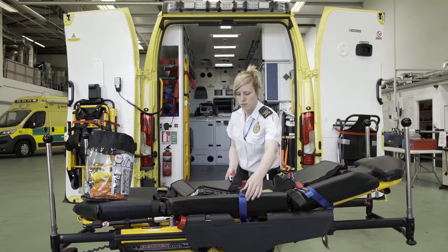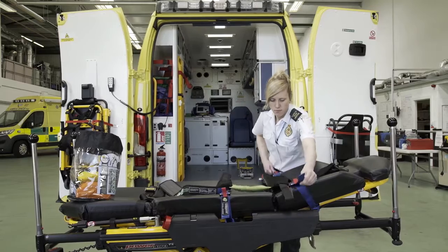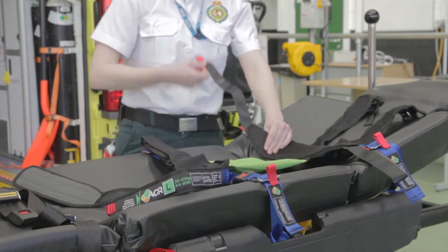Pull down each of the four blue harness straps to hold the position of the ACR on the cot. Once in place, fully open the straps located near to the top and bottom of the restraint.